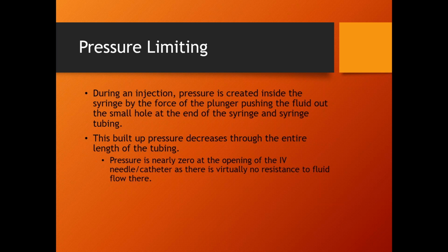Any questions? Now, again, that pressure limiting concept is a misunderstood concept, even by the techs who use the machine. 300 PSI or 1,000 PSI, whatever you select. Again, that's only in the syringe. That is not in the patient.